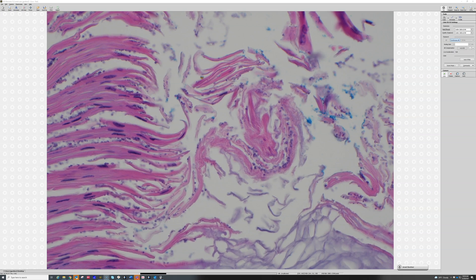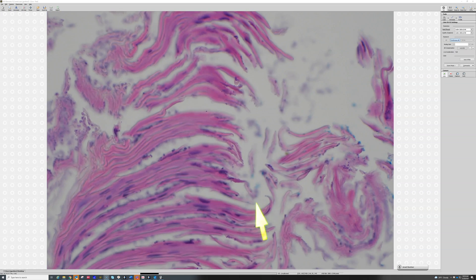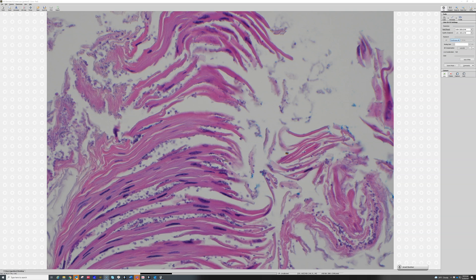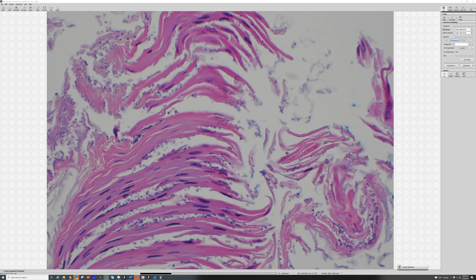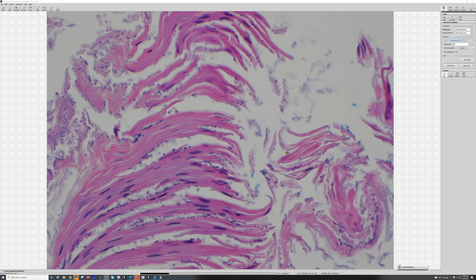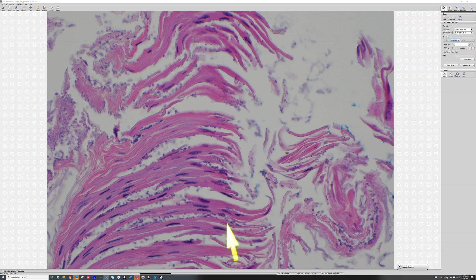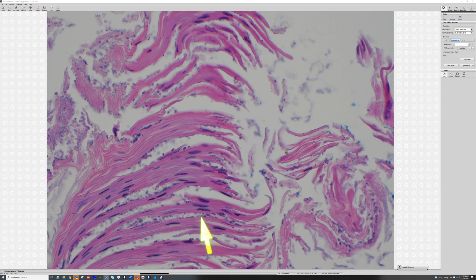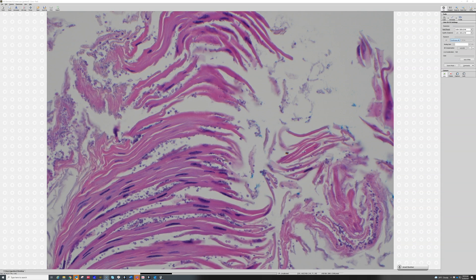In addition to yeast, look at these much, much smaller little dots — there are some really tiny dots that are much smaller than the yeast, and those are bacteria. Both yeast and bacteria are round, but once you see them side by side the size difference is dramatic. Those tiny ones are bacteria, and next to them you can see those are yeast — the yeast are like five or ten times bigger, much larger than the bacteria.